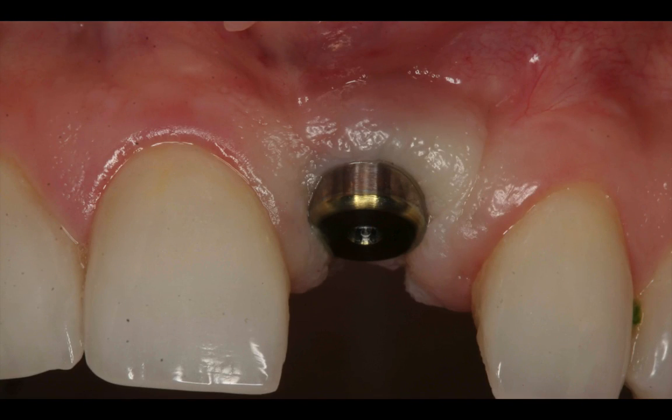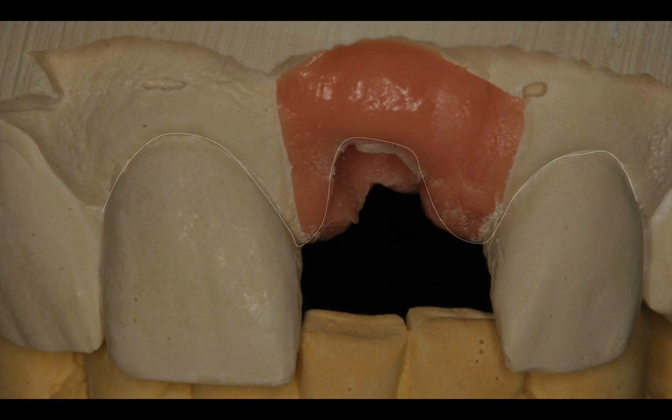I let the implant heal for a few months, and you can tell that we had pretty good soft tissue contours and good papilla that will allow for a good restoration that is naturally looking with good soft tissue around it. The only regret that I have is that I never saw the patient back for a follow-up with the crown, and I'm dying to see how it turned out.